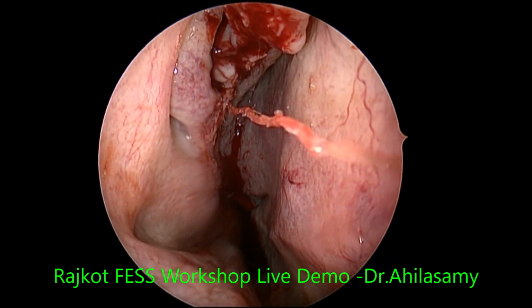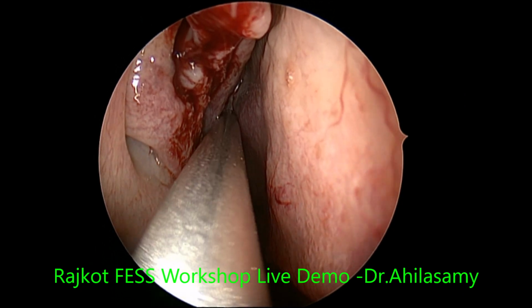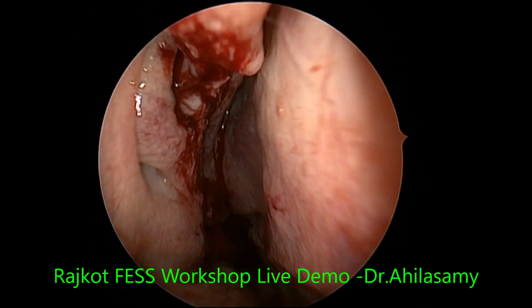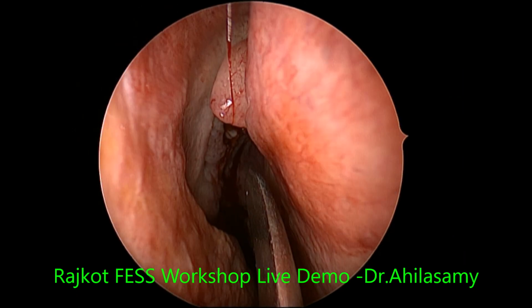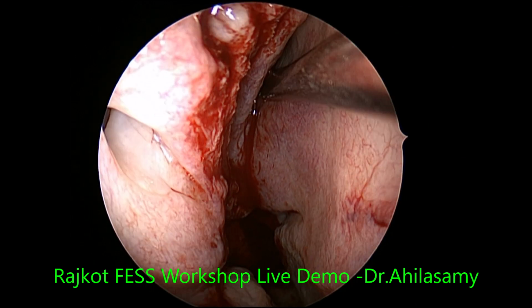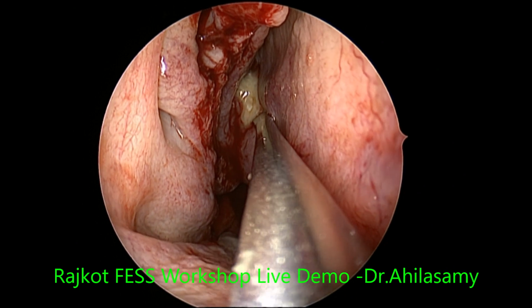So good hemostatic effect, and now you can have a little better glimpse of the sphenoethmoidal recess. That's the sphenoidal ostium area, which is a little polypoidal. Easy way to identify is go close to the septum with a small elevator and just slip it into the ostium. It's a small cartilage elevator, around 1.5 centimeters above the choana. Just slip it into the sphenoidal ostium and just press it open.